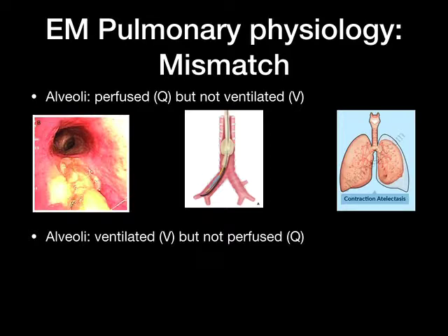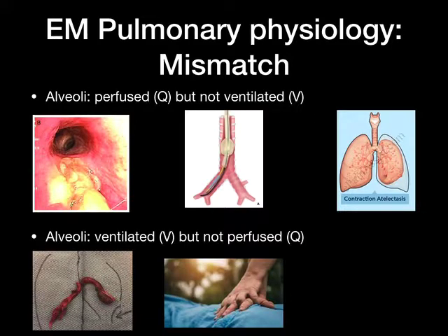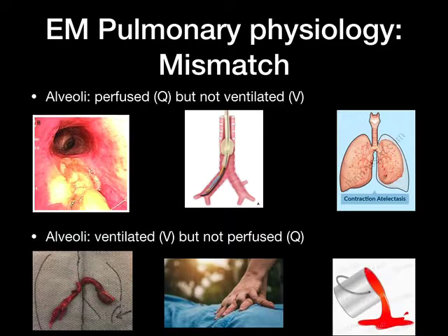There will also be cases where the alveoli will be ventilated but not perfused. Go ahead and pause the video again and think about what cases this might be. Well, you might see pulmonary embolism, certainly cardiac arrest would not perfuse, and any kind of hypovolemic shock.